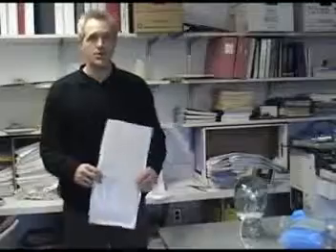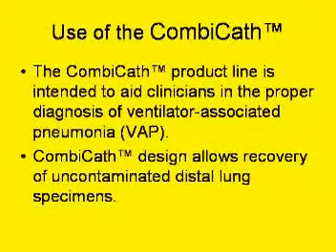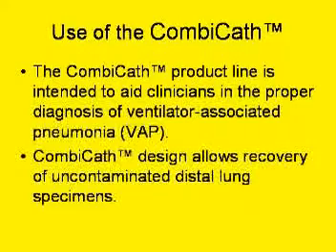My name is Ryan McInerney. I'm with Cole Biomedical, and we're the company that distributes and markets the Combicath in the United States. The Combicath is a catheter that's being used widely in Europe and now in the U.S. for accurate diagnosis of VAP, ventilator-associated pneumonia, in the ICUs.